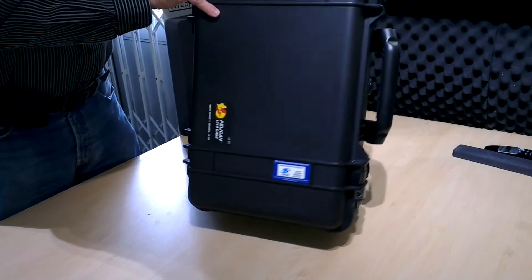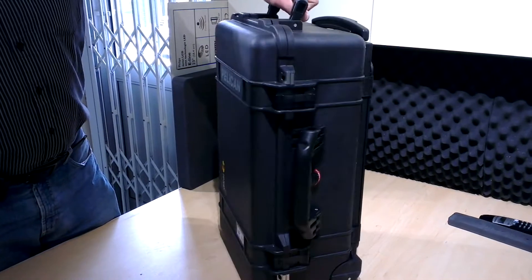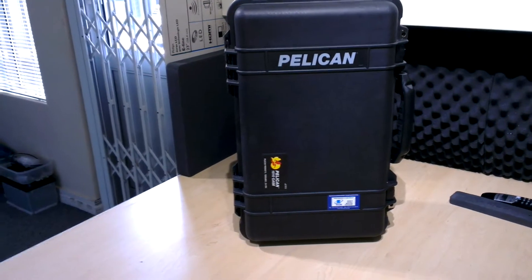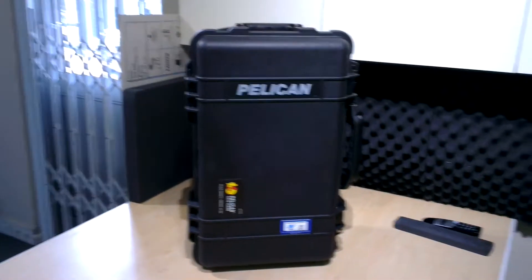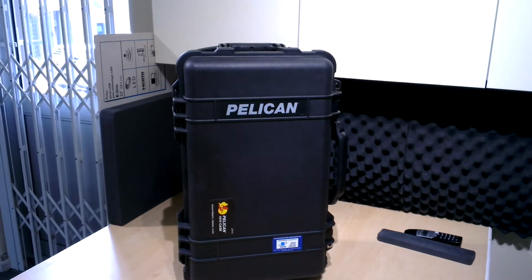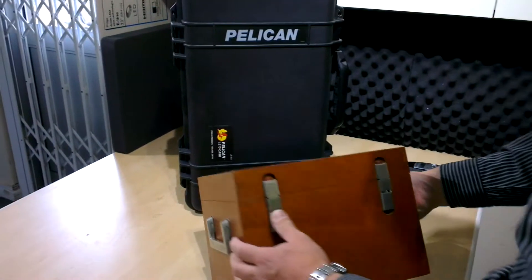Those who do audiometer calibrations will appreciate that it is quite a challenge to get this into a relatively small case. Previously, one of the things you would have to carry with you is the bulky unit here, which really is almost half the volume.